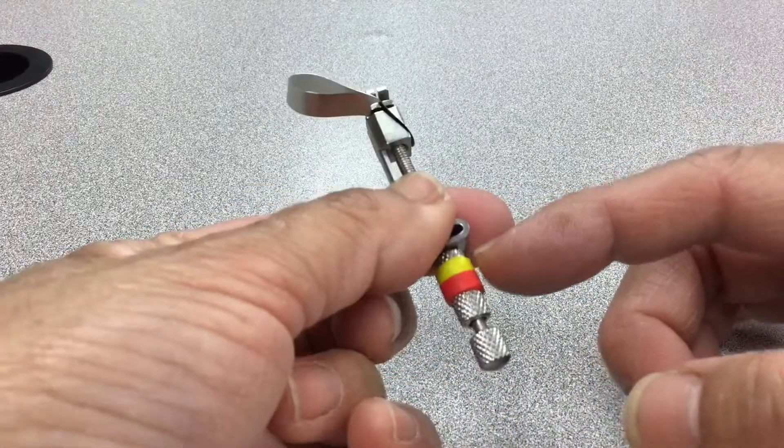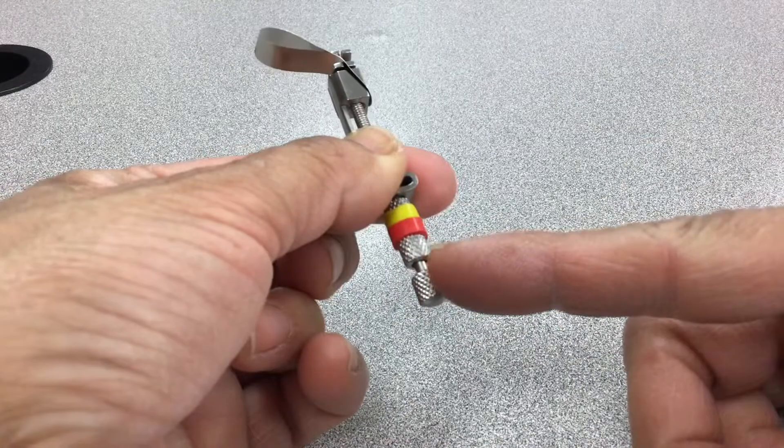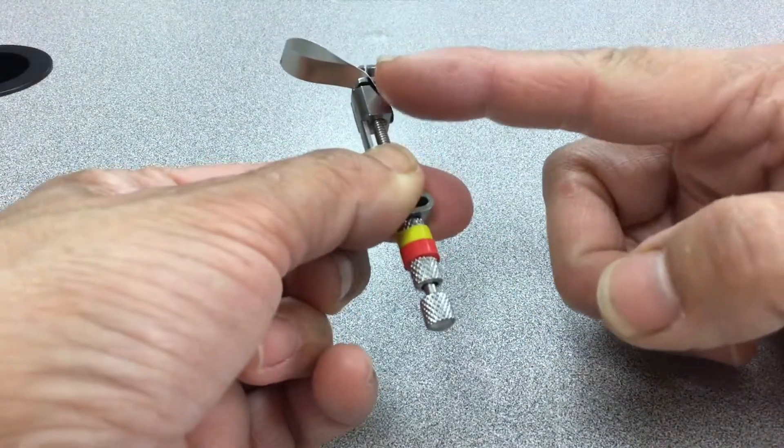So this tightens it to go around the tooth. This tightens the band onto here.